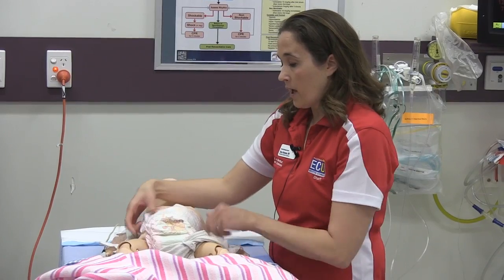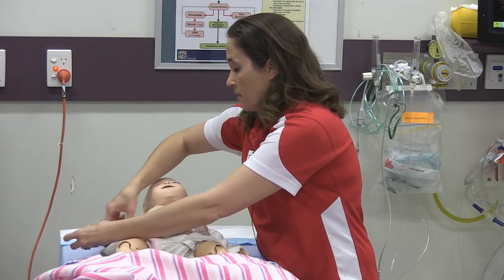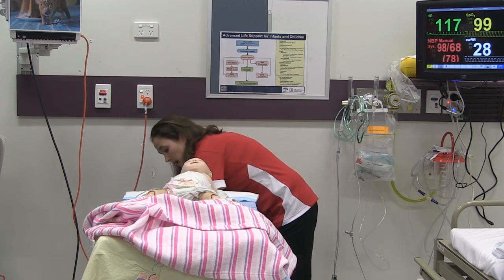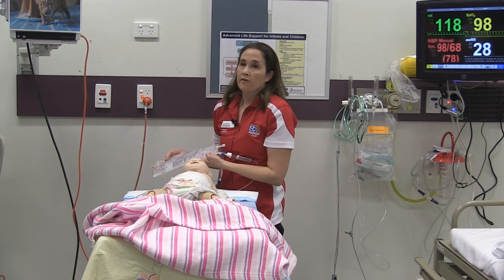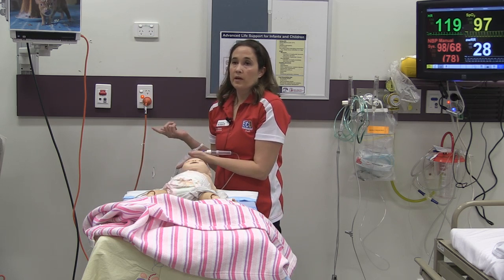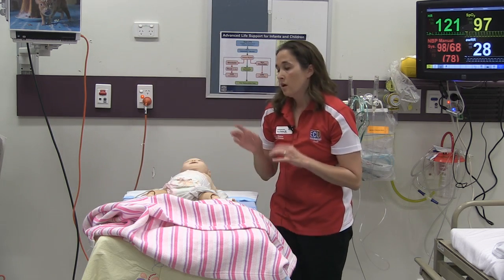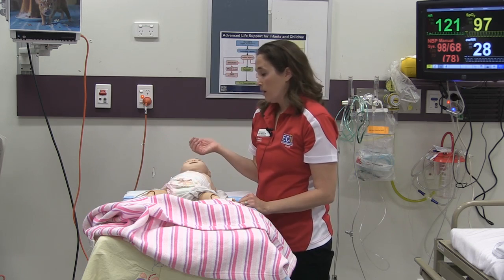Generally, Manikins have a pulse arm and an IV arm, and this side we've equipped with what we call the false cannula. We'll talk about that a little bit more, but it's basically a false cannula that is attached to a dump bucket. That way the learners can give as much fluid as the bag will allow, and you can obviously change the bag size, as much fluid or medications as needed without worrying about flooding the Manikin. Because again, a lot of the learners that come through this high fidelity simulation center, we're not focused on if they can put an IV in or not. That's something that you can do in a task trainer situation.